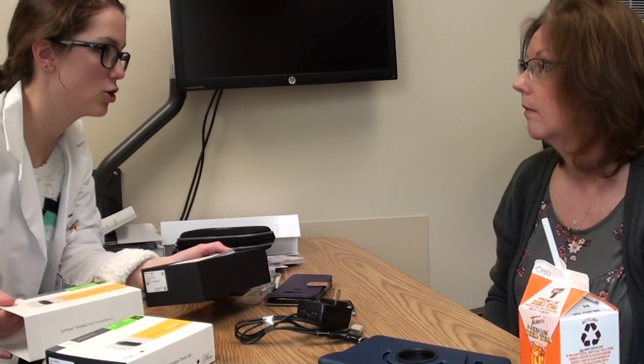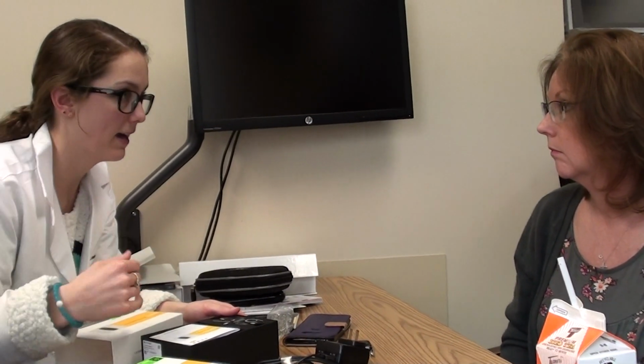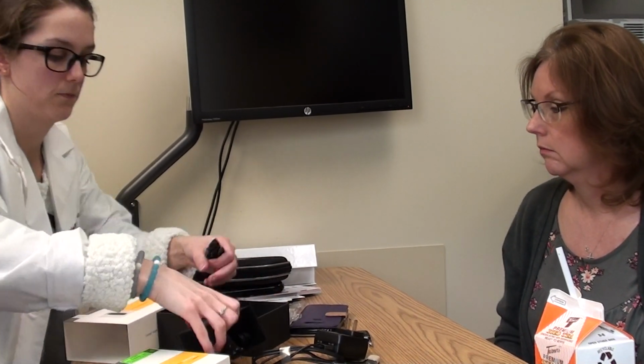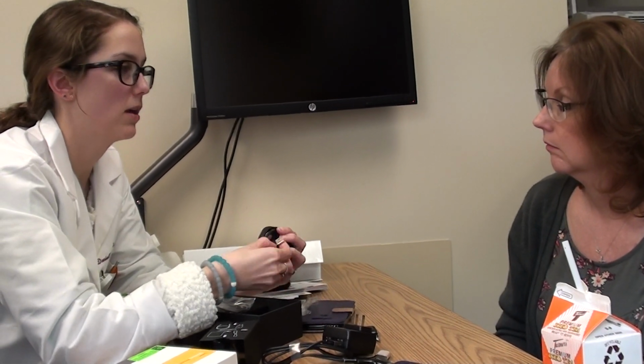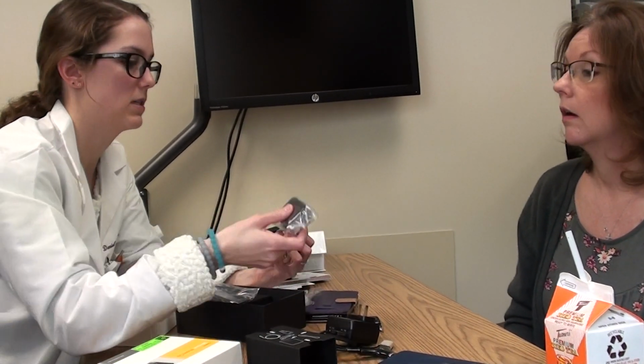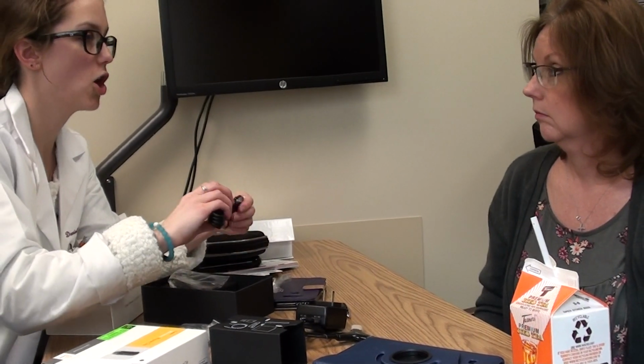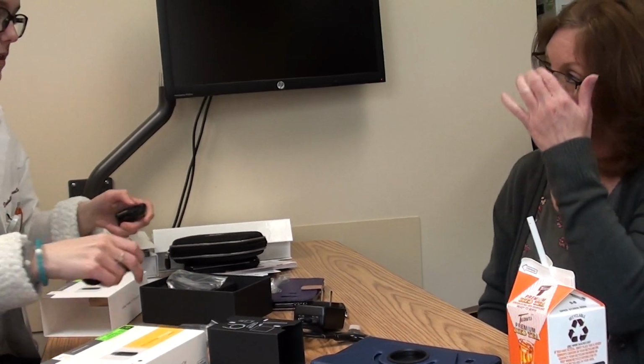Okay, so then you have a couple accessories that we're not gonna go over today, but bring them back and we'll talk about them in the future. But you should charge them, so that way they're working and charged up when you come back, okay? Charge them before you come back. So this piece right here, you're gonna plug this in here. And then same thing, there's a little piece in here that you can plug into the wall. That's the same one as this? Yep.